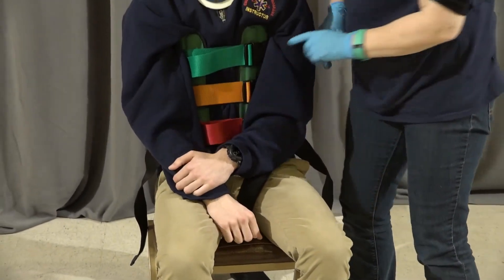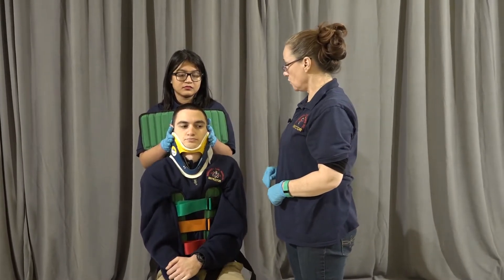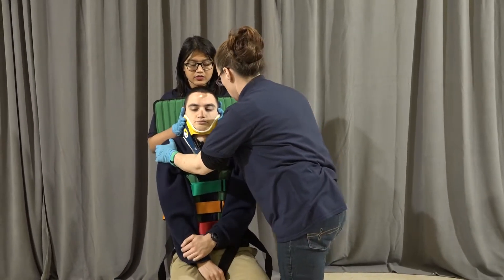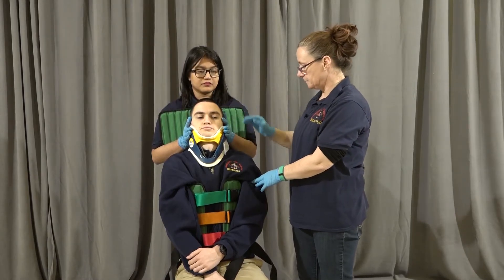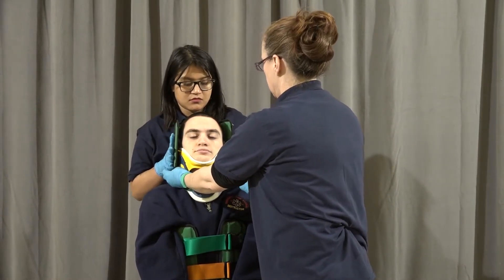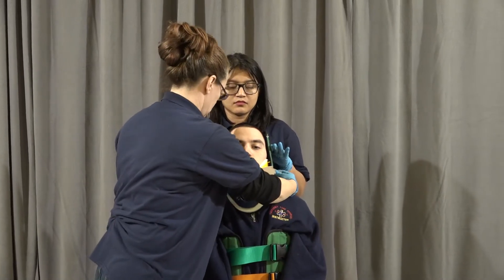Make sure all my straps are good. Once secured, I'm ready to move to the head. I'm going to take over control of the head myself and check the space in the back. In order to fill that space, we're going to roll the shoulders on my partner's count, moving back and making sure we have no space. If there's still space between the padding and the head, we're going to pad that with some trauma dressings or cushioning. I'm going to hold the head now. My partner is going to bring in the head flaps, and I'm going to get the head straps — one secures the chin straight back, and one secures the forehead.